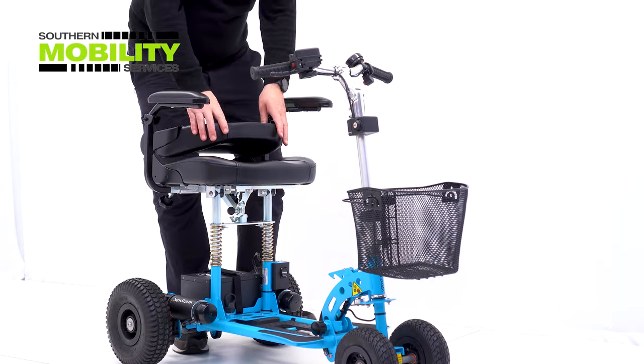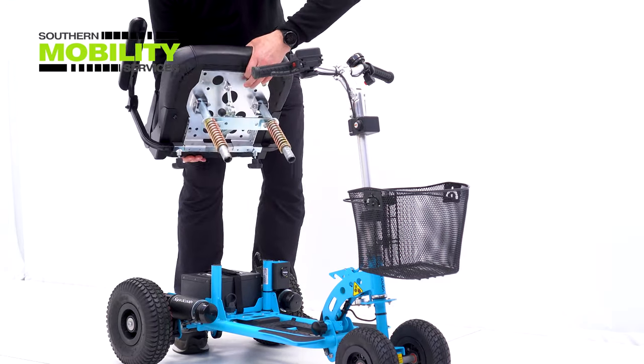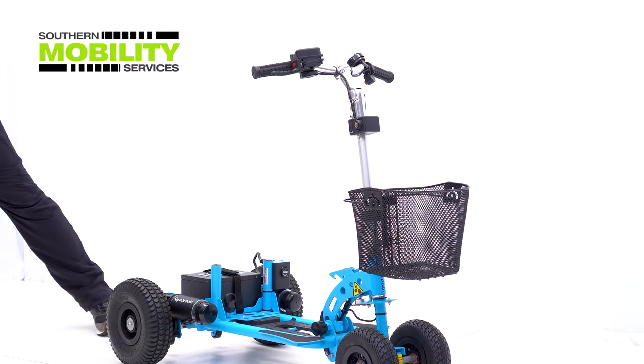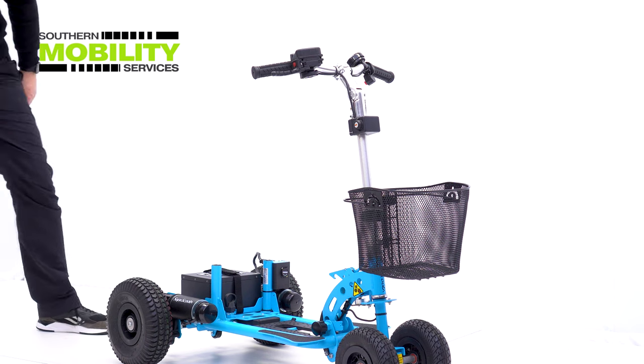The Sport HD comes apart to easily fit into a car boot. First thing we do is lift off the seat and a quick pull of the seat pin to fold and put to the side.